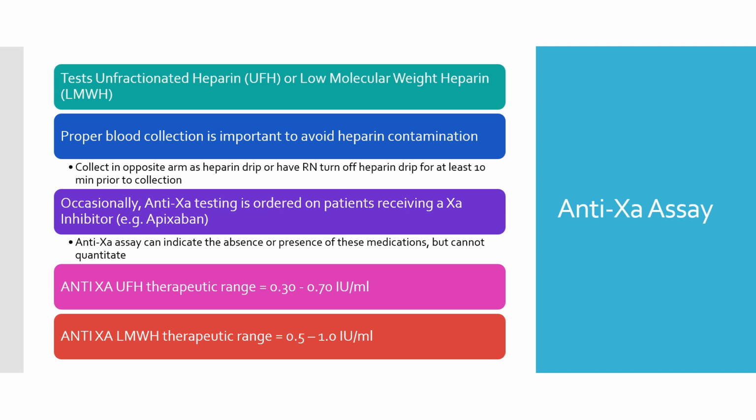Okay, the last assay that I want to talk about, or last of the routine testing that I want to talk about, is our anti-10A assay. Now, we utilize this test to specifically test for heparin. That could be unfractionated heparin or low molecular weight heparin.